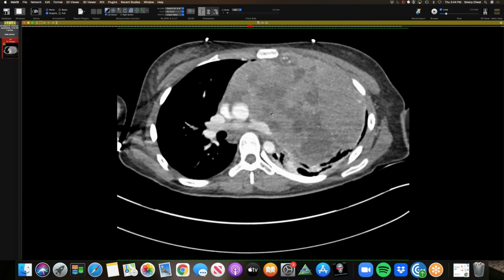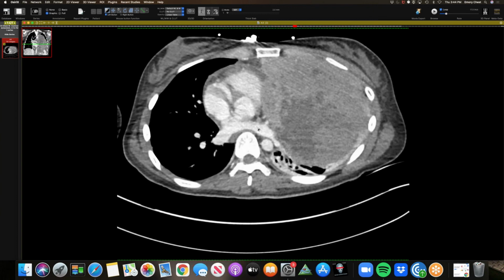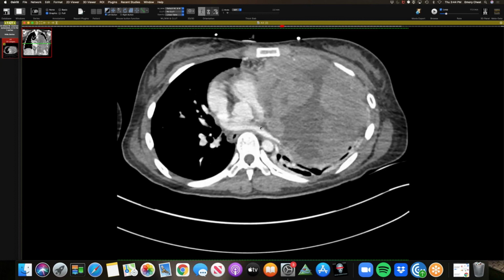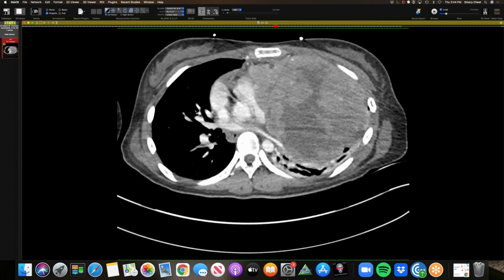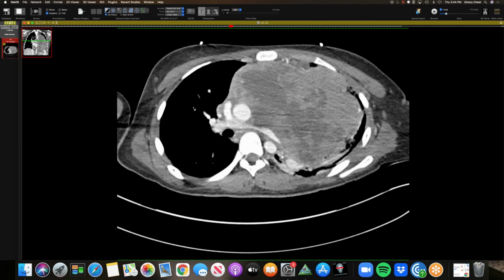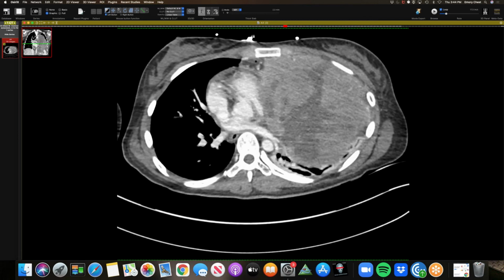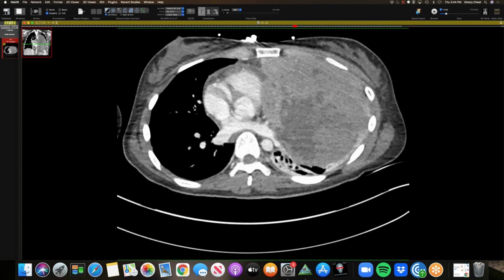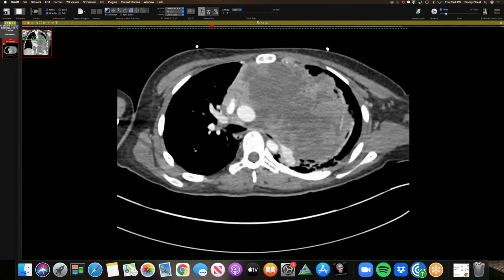It's impressive for lymphomas. Usually the teaching is that it grows around vessels instead of compressing. It's so big, there's nowhere else it can grow. I mean, yeah, there's major compression there. And that's also more for non-Hodgkin. Anyways, the primary mediastinal B cells can do some invasion and compression, but yeah. Hopefully she'll respond well. She's only 20.